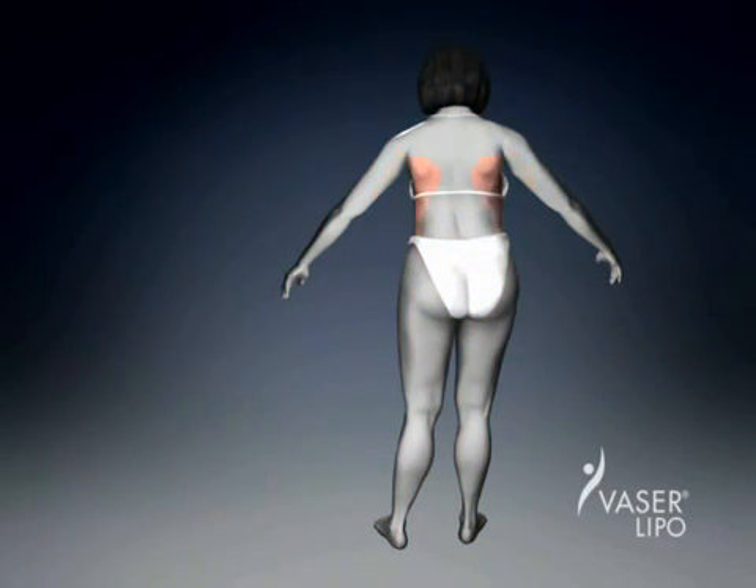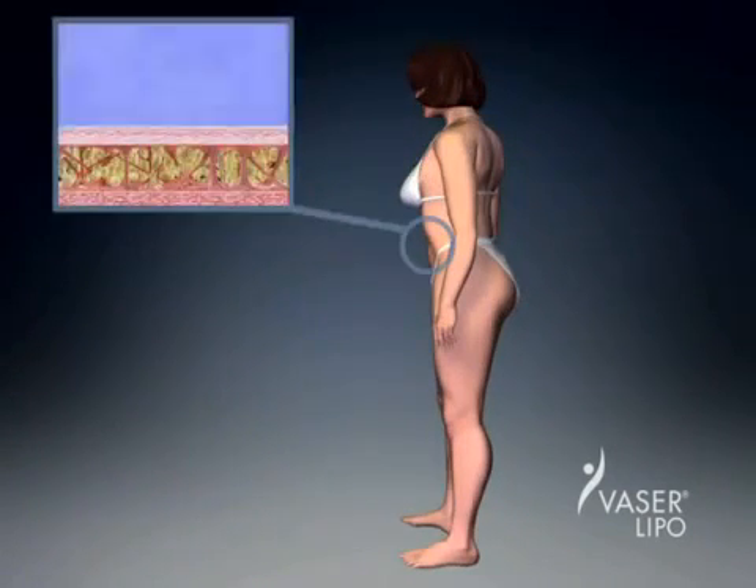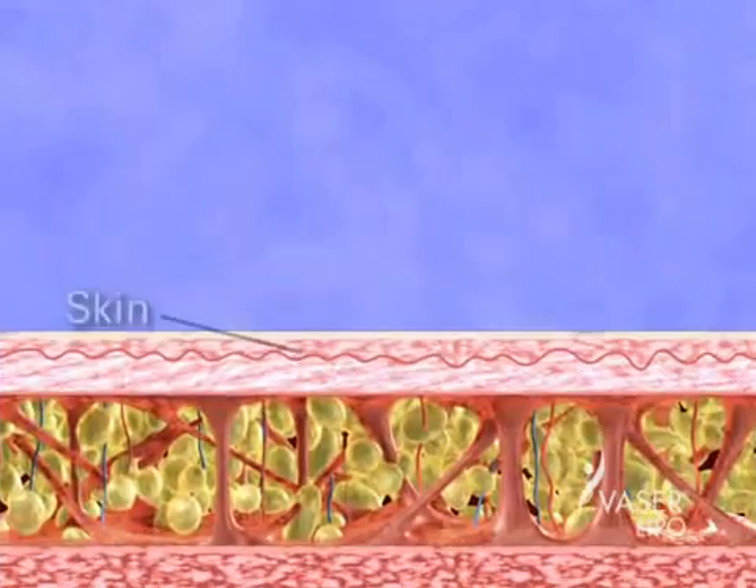So, how does this new fat removal technology work? Let's take a closer look at a cross-section of an area to be treated with VASER lipo.